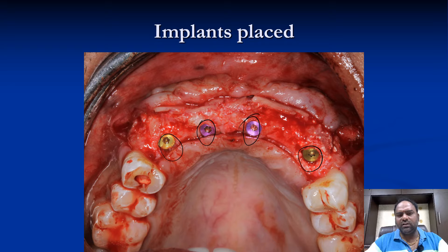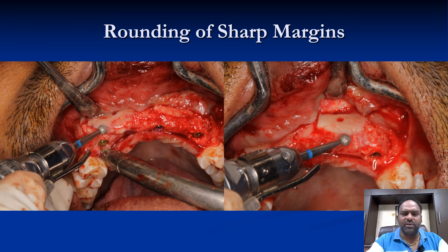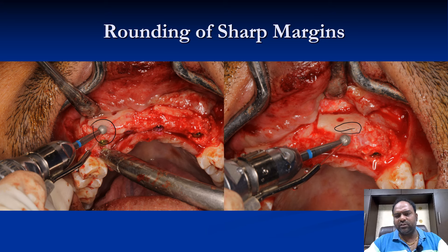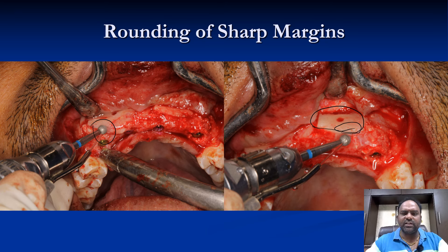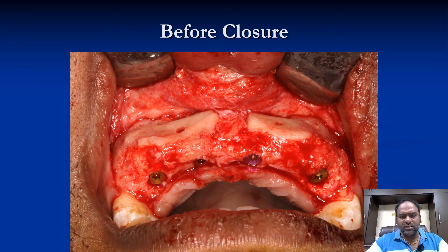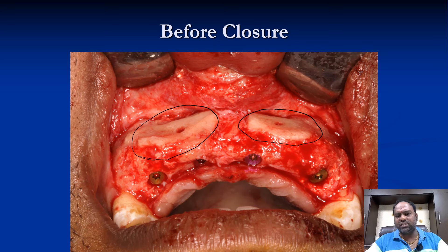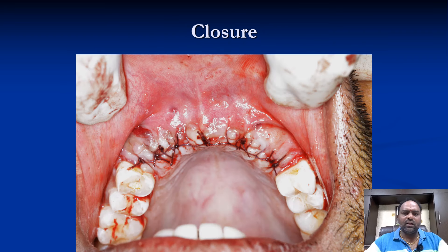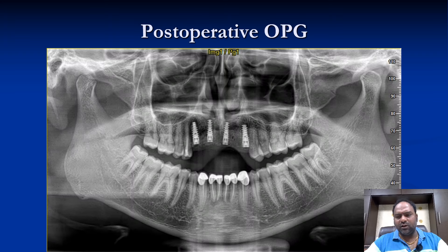All four implants were submerged and closure was done. Wherever there was sharpness from the autogenous bone, we reduced those chips to a blunt point using a coarse bur. You can still appreciate the amount of bone present. The autogenous plates are also holding the bone, and there is fresh blood — a very good sign indicating they have been well accepted at the recipient site.